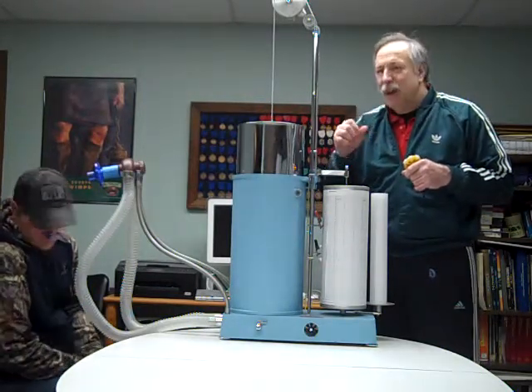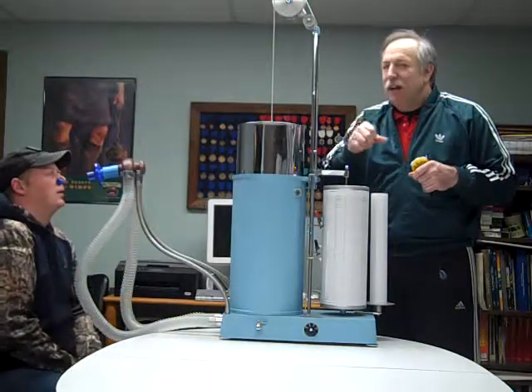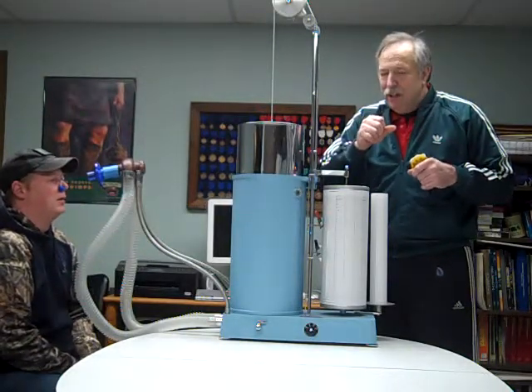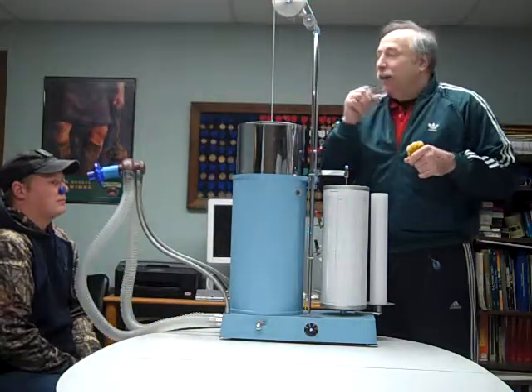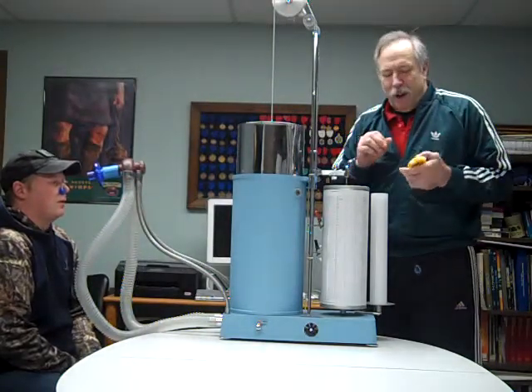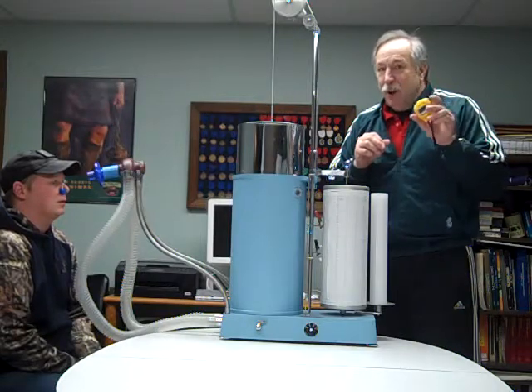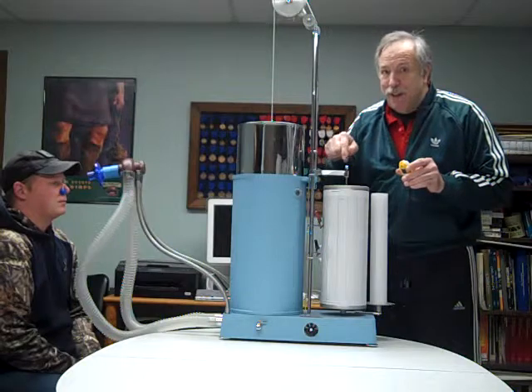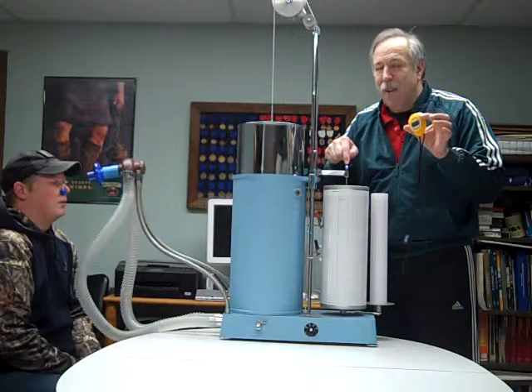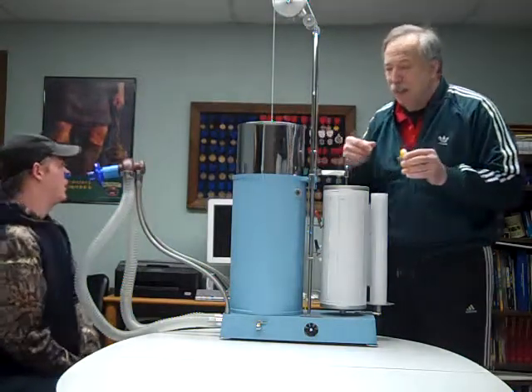The speed is kind of important, and the depth. He's going to go as fast as possible, taking in 50% to 75% of his vital capacity as quickly as possible for 15 seconds. I do have a stopwatch, but we don't really need one because the drum, when it does one full rotation, will be 15 seconds. But this will give me an opportunity to give him some encouragement and tell him how much time is left.